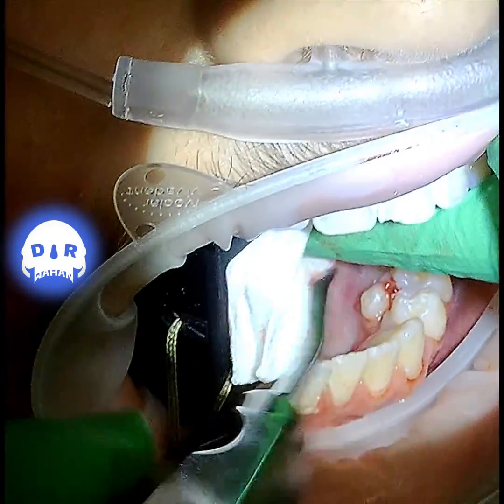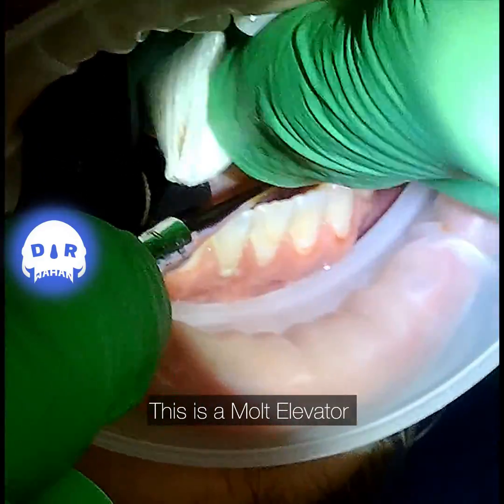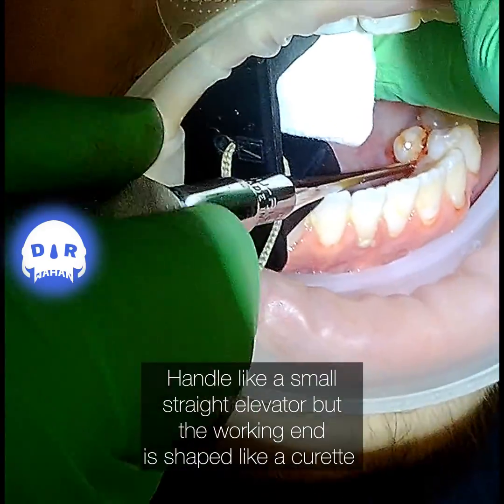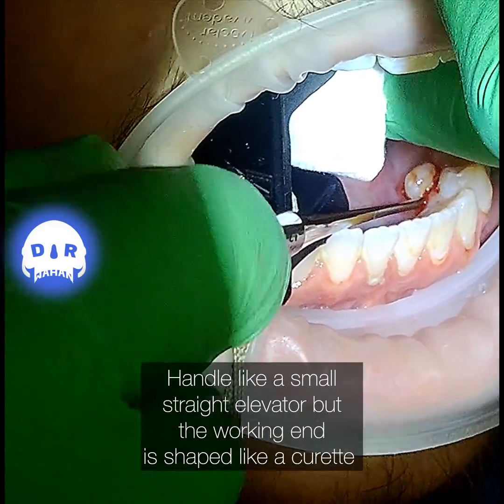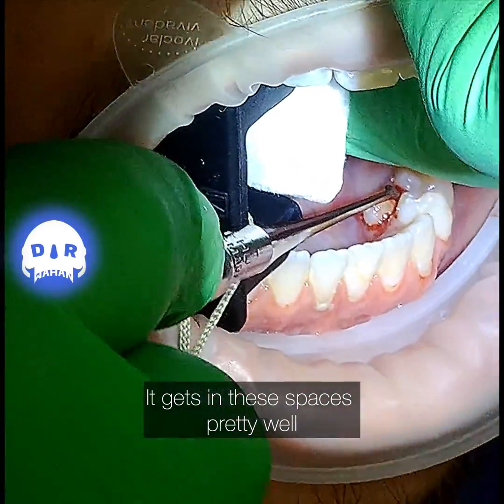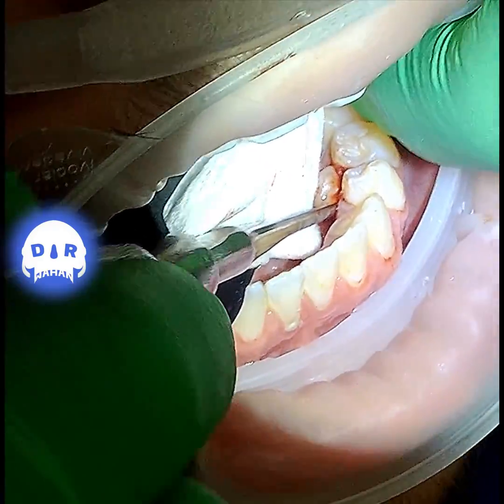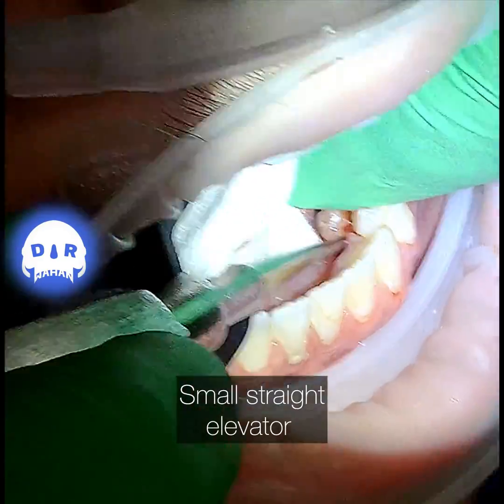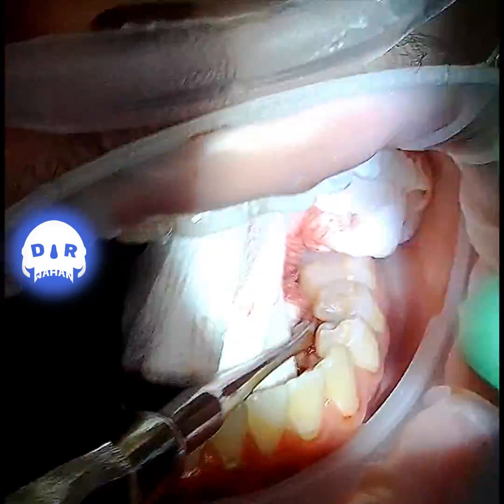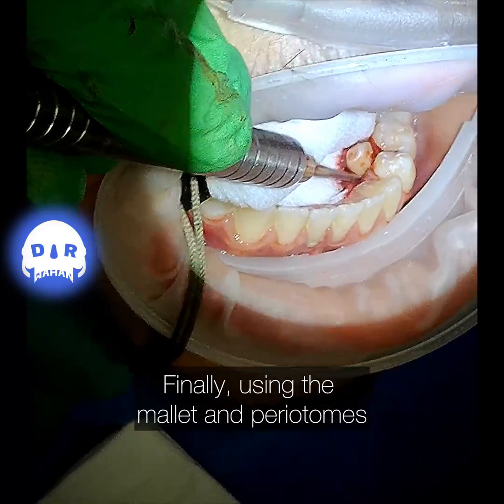So careful when elevating — you'll see my finger a lot of times go on the front part of the adjacent teeth, the buccal aspect, just to gauge how much pressure the elevator is giving as I go. Some pressure there, so I'm kind of working it from all angles. It's pretty solid, not really moving much at all. Trying different instruments and elevators — the mult elevator actually created a little space, so I got the straight elevator in right after that, but still wasn't enough.